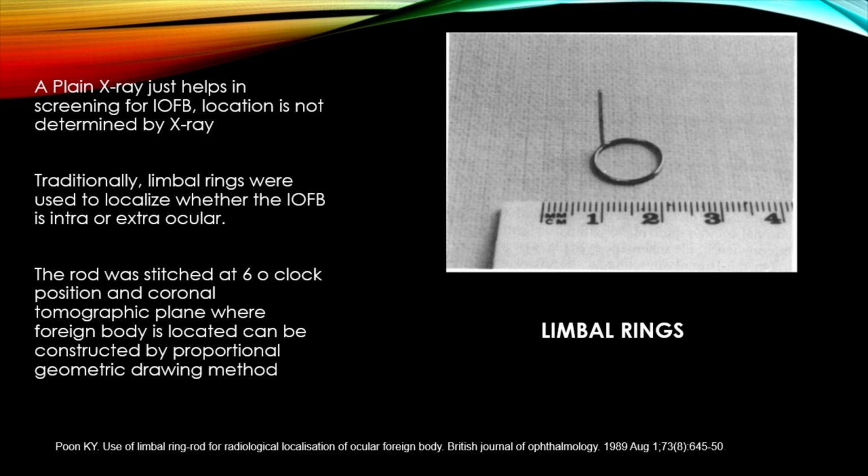This was used actually with various sensitivity. Intraoperative, you also try and localize the foreign body. These are all history again, but called Berman foreign body localizer. This is all history, right? So leaving that aside, now coming to the present day, there's one mistake somewhere I wanted to see.